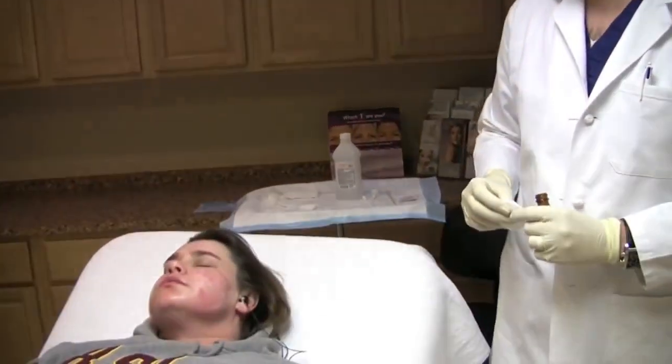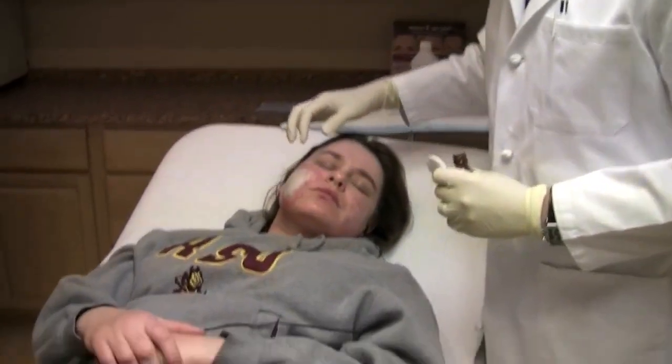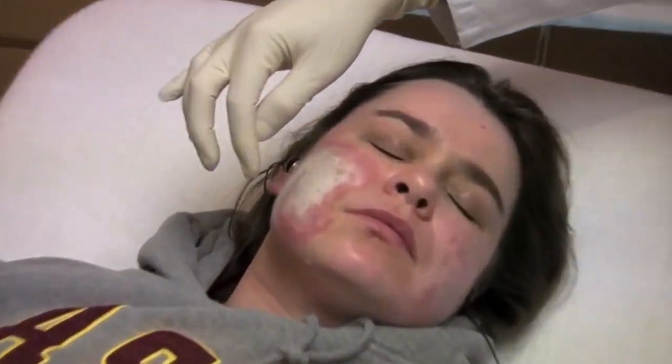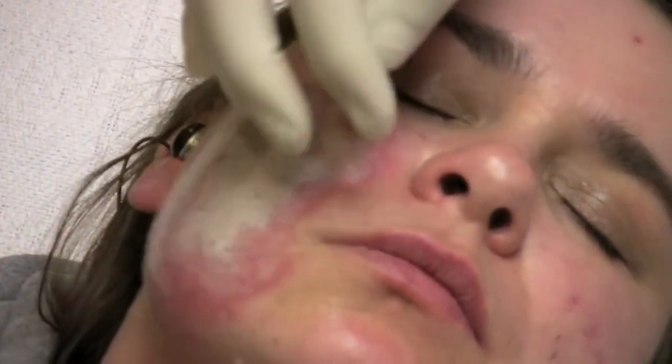Okay, so we've let this other side sit. Let me have you turn your head a little bit this way. You can start seeing the frost is wearing down a little bit. There's a zone of erythema or redness around it, but the frost is shrinking. In a few hours, this frost is basically just going to be red. In a couple of days, it'll turn brown. It starts peeling, and she'll start her routine at home. Now, after giving it about 10 to 15 minutes, we're going to come and do the other side. Again, 88% phenol.